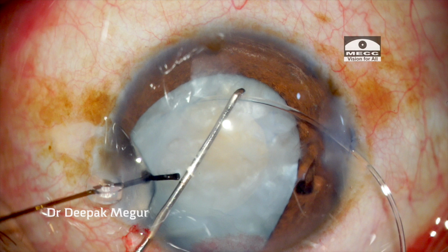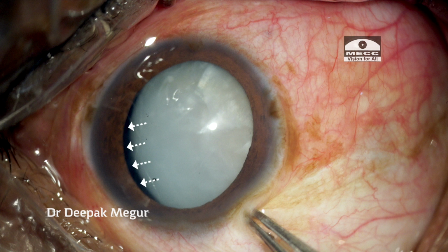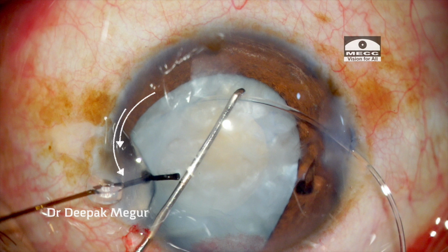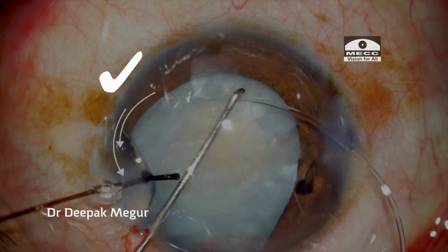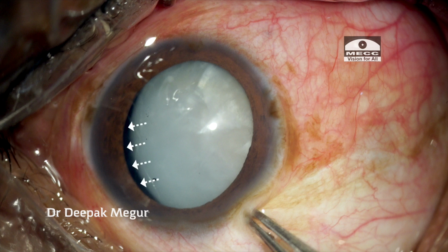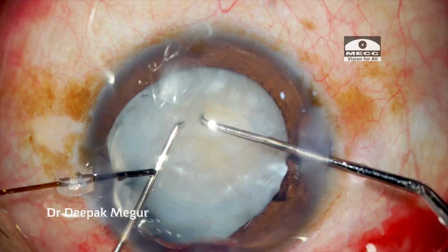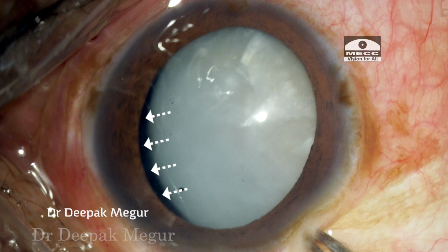An important concept we need to understand regards the site of insertion and orientation of the ring when being used in such eyes with localized zonular dehiscence. The thumb rule is to ensure that the ring when introduced should support the area of zonular dehiscence first, followed by supporting the healthier areas of the capsular bag. In this case, the CTR is introduced and supports the area of zonular dehiscence and then is gently maneuvered so that the remaining part of the capsular bag is supported well enough.